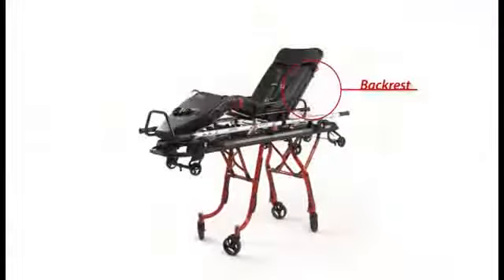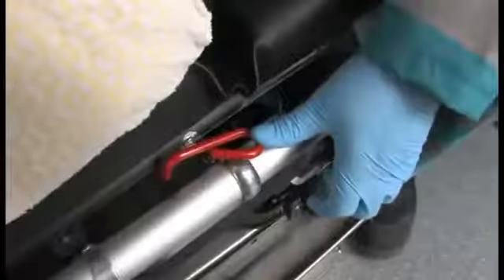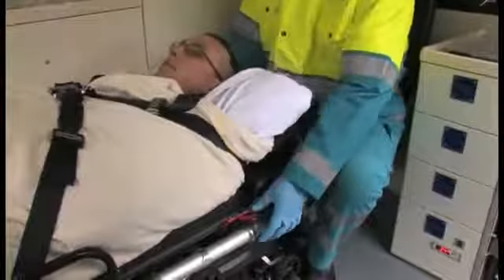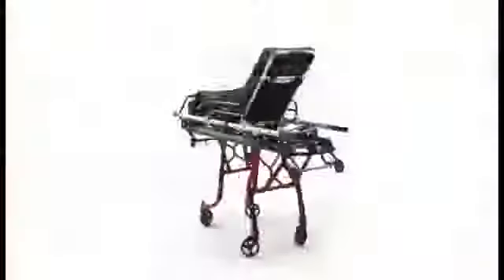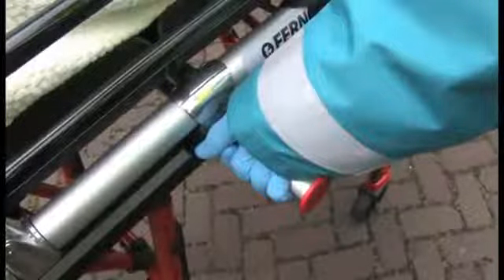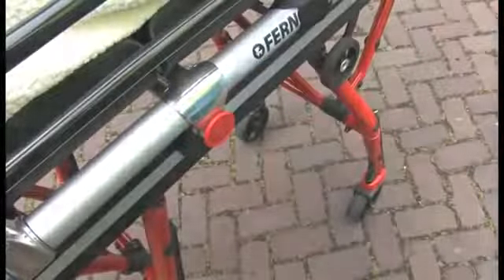To adjust the backrest, press down on the red release levers on the stretcher and lift up to raise the backrest to the desired height. To lower the backrest, press down on the red release levers and push down on the frame. When additional lift assistance is needed raising the cot, pull out on the red tab to engage the side lift handles. Push the tab in to hide the side release handles.